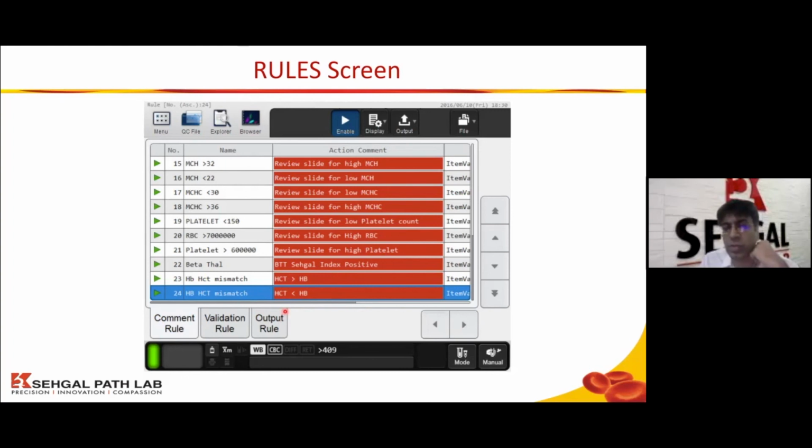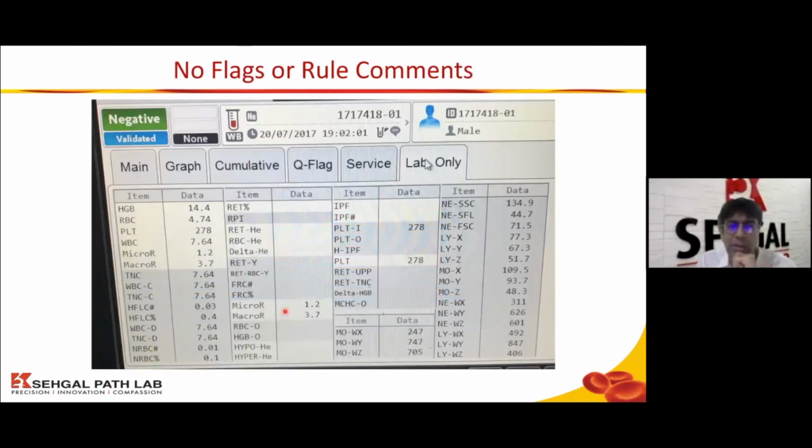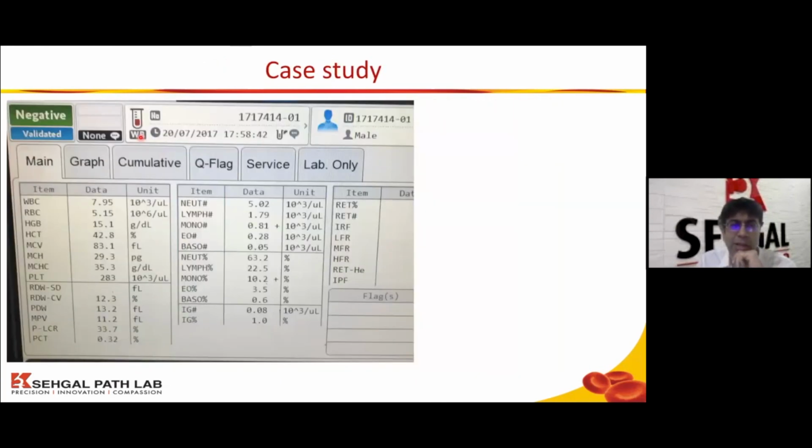So the idea is to inspire the young viewers out there: you can define your own algorithms, you can create formulas. The current analyzers, middleware, and LIS give you the opportunity to put your formulas into the system. So not only will you get good results, you will train your technologist to get more efficient data out of your CBC analyzer. So again, an example, there was no action alert, no flag, there was no cloud here, a negative you could verify, and without seeing the rules, without seeing the slide, you could validate the case.